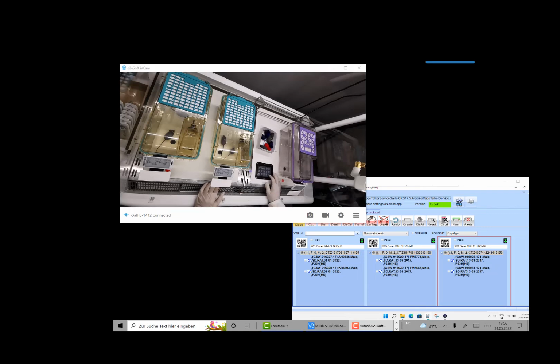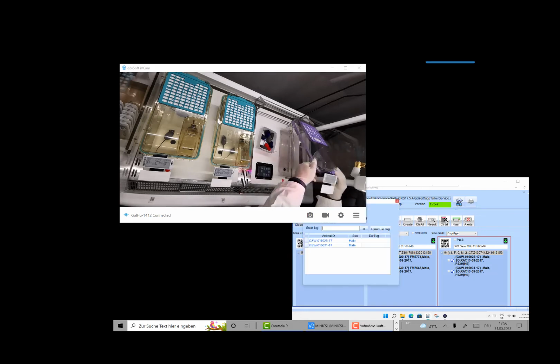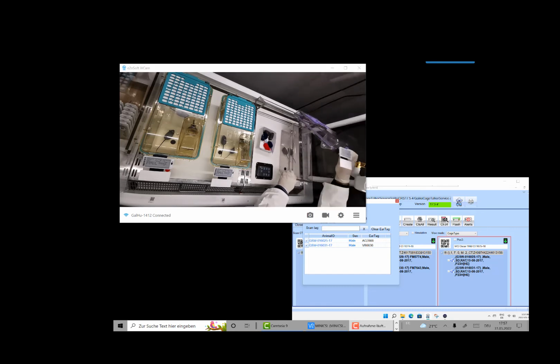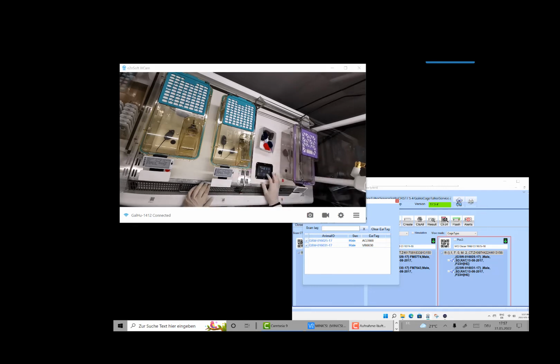And you press EarTags, you open your cage, okay, and we take in the animals. 1, 2, close the cage. And also say OK.